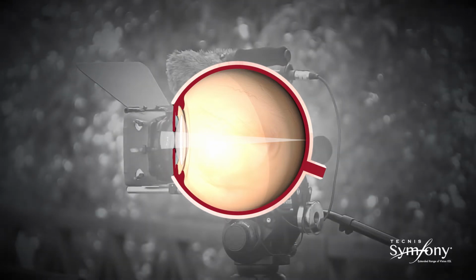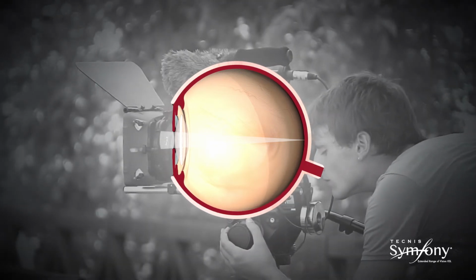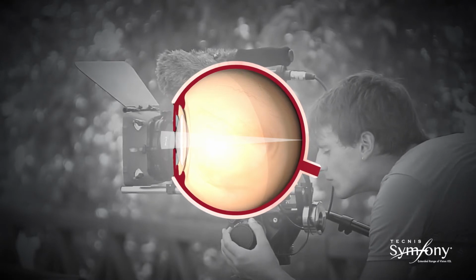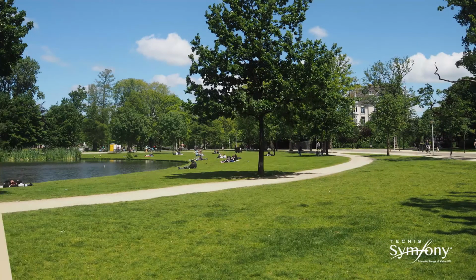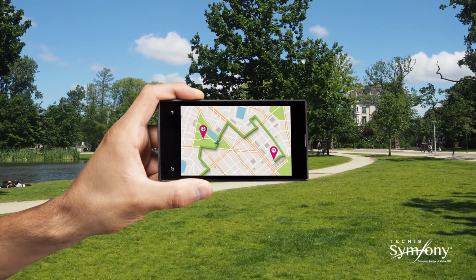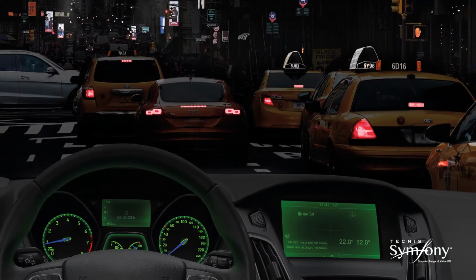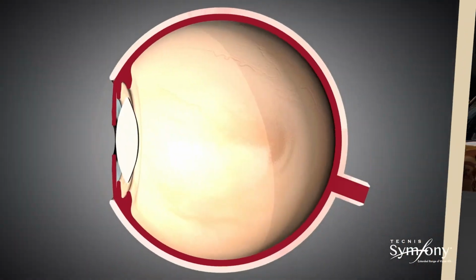This is similar to examples in the photographic world, where refractive and diffractive lenses are also combined to correct chromatic aberration. Correction of chromatic aberration results in a sharper focus of light and increased image contrast, which is especially important in low light conditions.